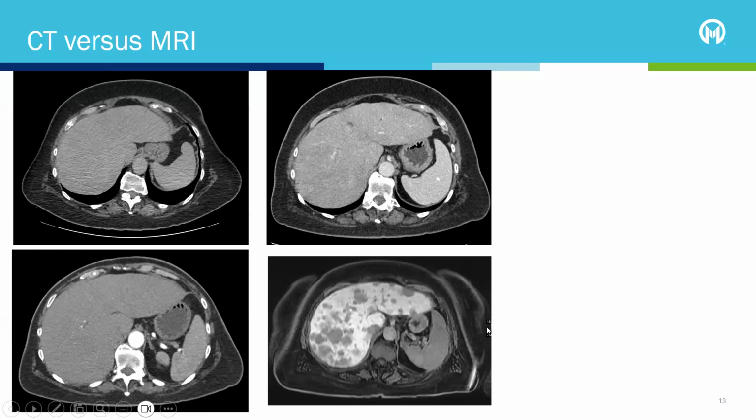And so this patient went on to an MRI, and you can see here lots of disease, cancer in the liver. And we certainly were not getting that idea on many of these scans. And so this would be a huge change for this patient. And CT definitely works well on neuroendocrine tumor and just cancer imaging in general. It's definitely adequate most of the time.